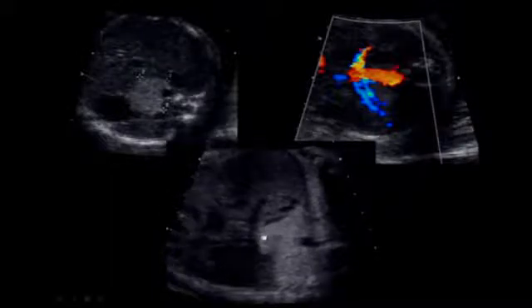And on this coronal clip, you can see here's the beautiful diaphragm coming across, and here's the sequestration protruding through the esophageal hiatus to make a little tiny mass down on the left side, infradiaphragmatic portion of it.